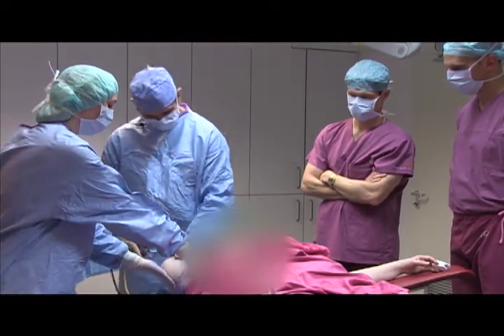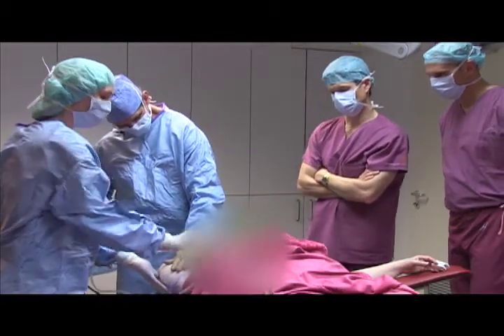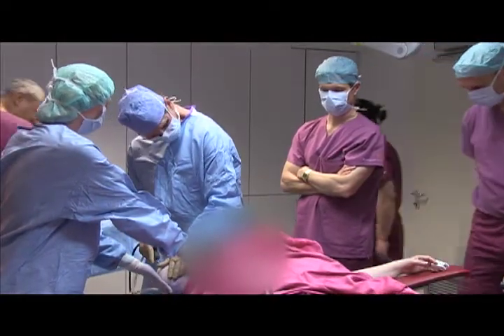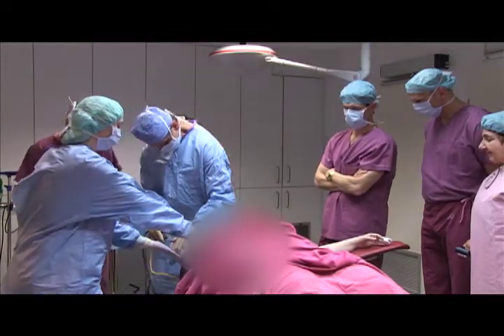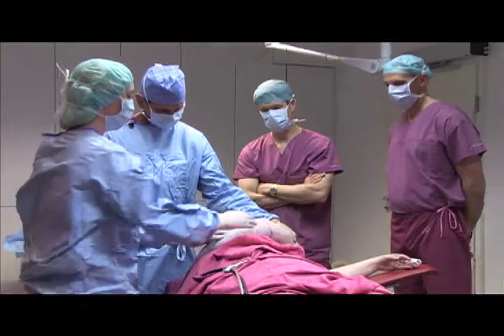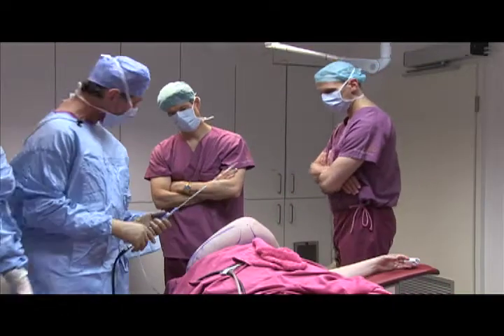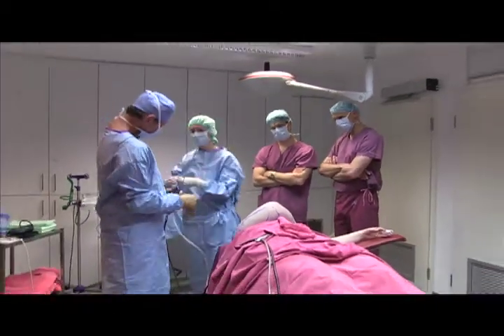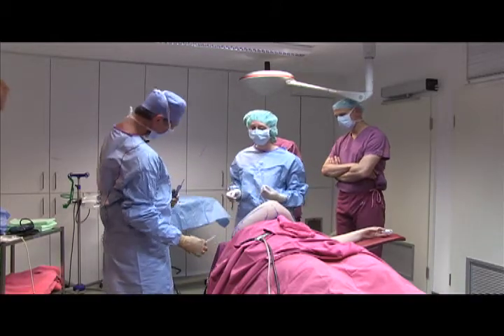So what I do again — I'm below the Camper fat fascia. This is just the start. Now this is the second incision here.